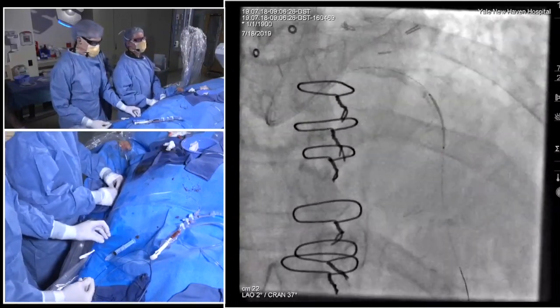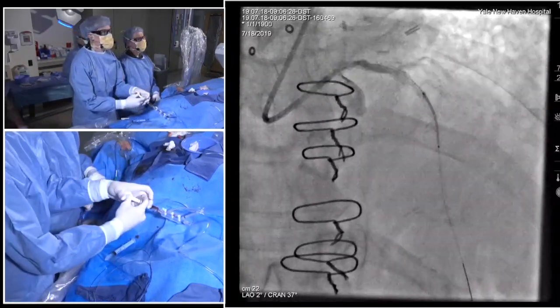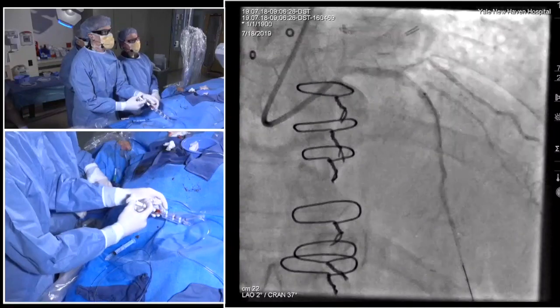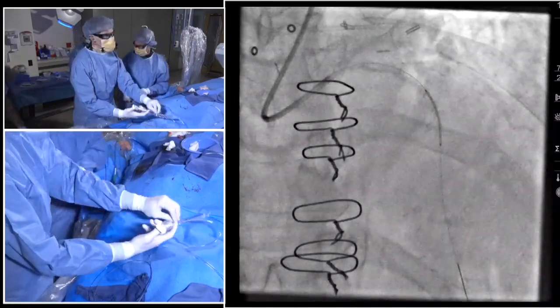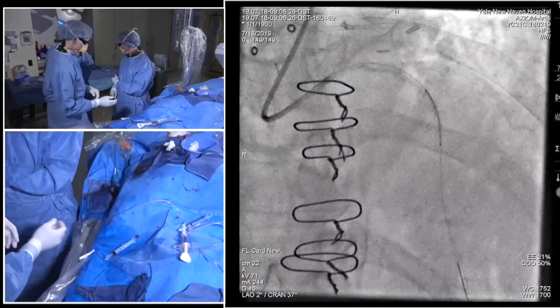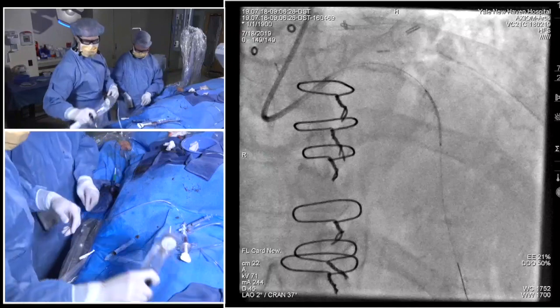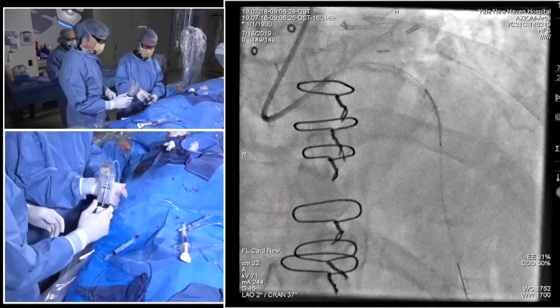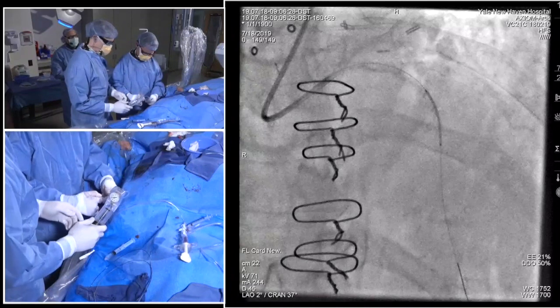It used to be just retrospective data. We now at least, what stent is this you're putting in? We're putting a 2.5 by 24 Synergy. With Synergy, at least because of the SENIOR trial, there's some data now prospectively with 1 month DAPT and then a longer cohort of patients with ACS that had longer duration DAPT.